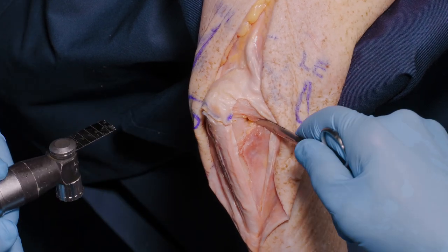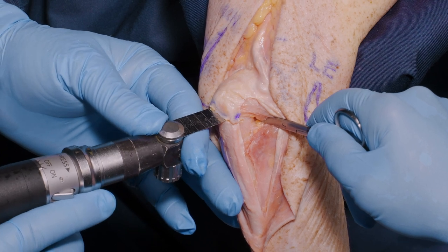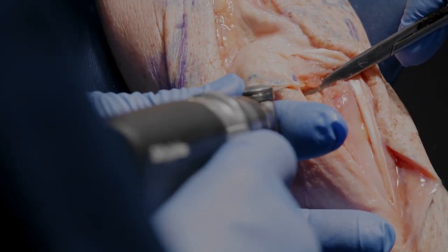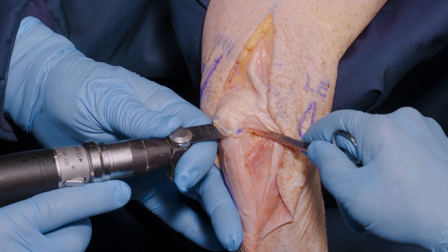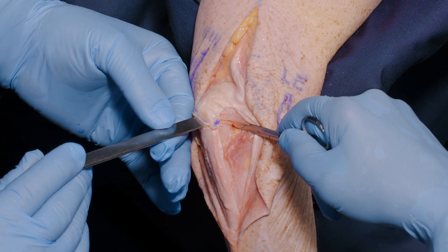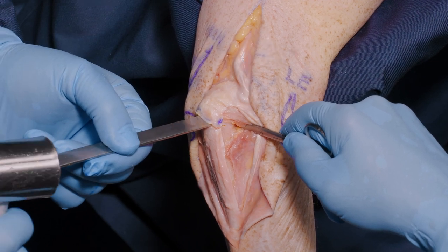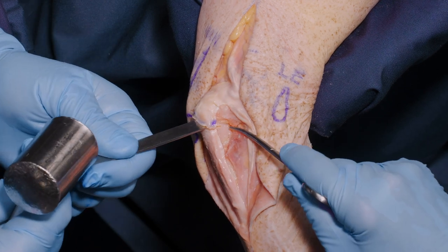As a safety precaution, you can put a blunt instrument underneath to protect from the saw cut. Continuing with the lateral saw cut, rotating the saw so that we do not risk damaging the humerus at the depth of the cut.